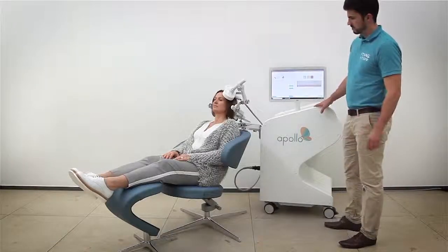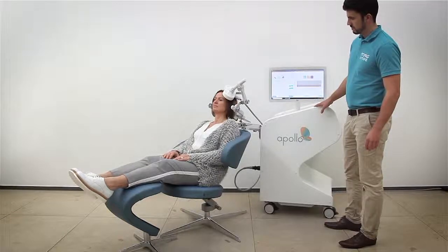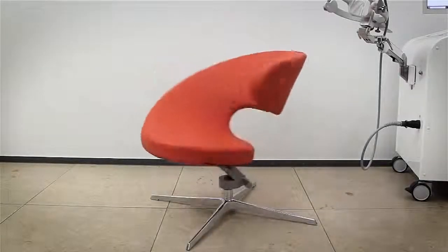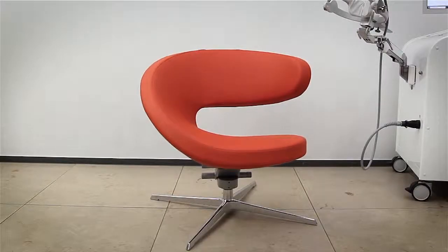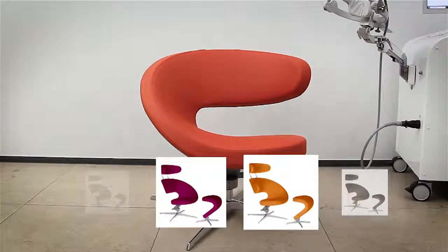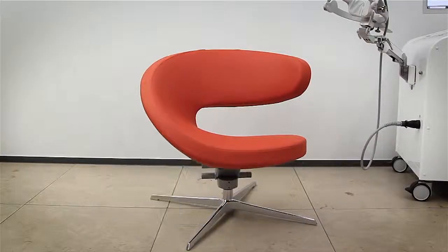Setting up treatment sessions and generating reports has never been easier. You can customize your Apollo as the designer treatment chair is available in six different colorways and two different textiles.